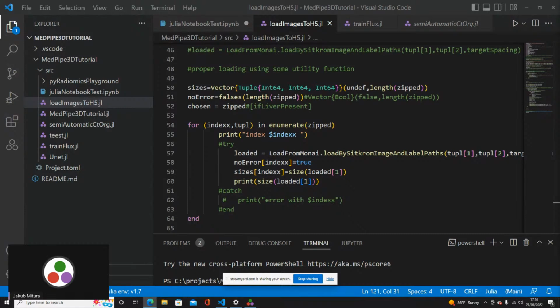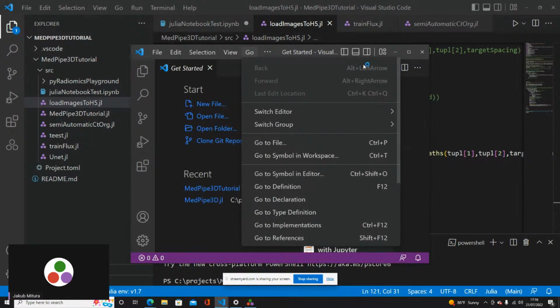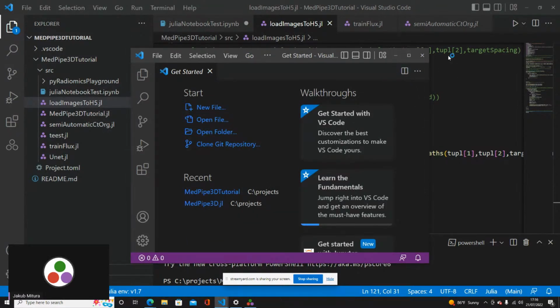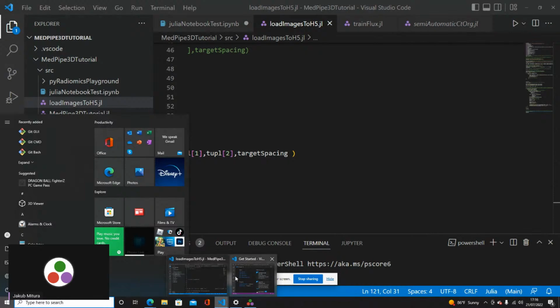Because in order to install NumPy, you would need to change it a bit. A moment, and I will just help you with it. It does not want to work with me.